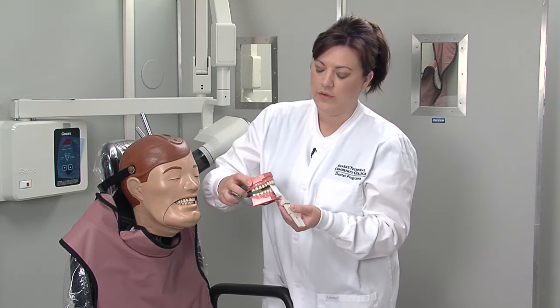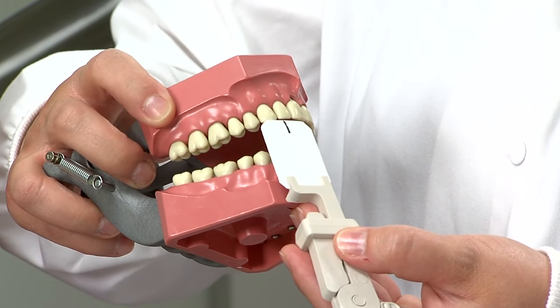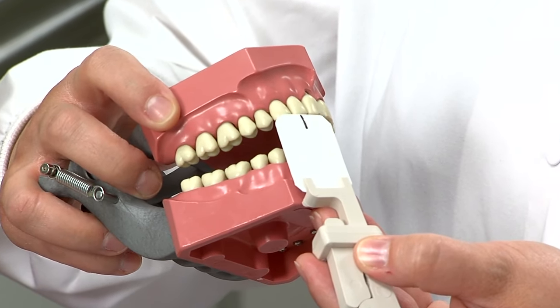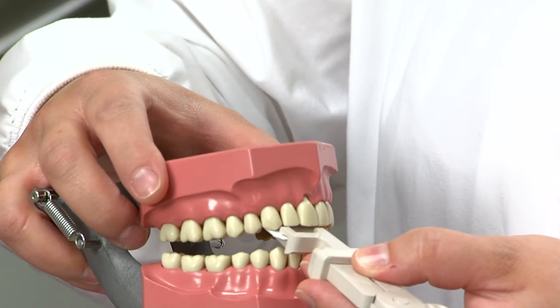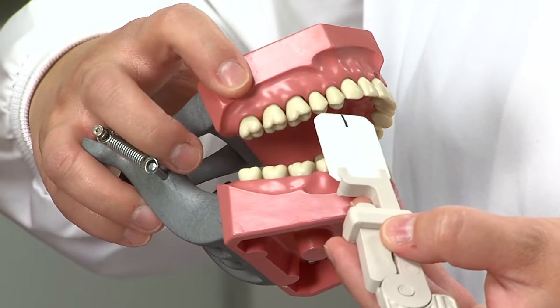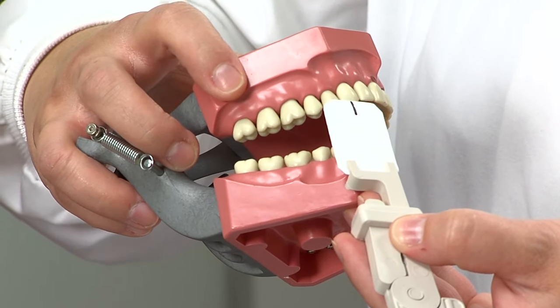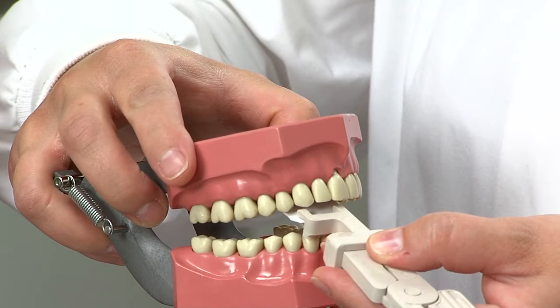Moving over to the maxillary lateral, we would line up the center of the film with the middle of the lateral incisor — the placement would be exactly the same. And then for the canine, we would simply line it up with the middle of the canine, and the patient would bite down in exactly the same manner and hold on to the film.